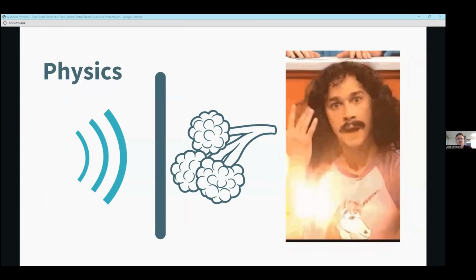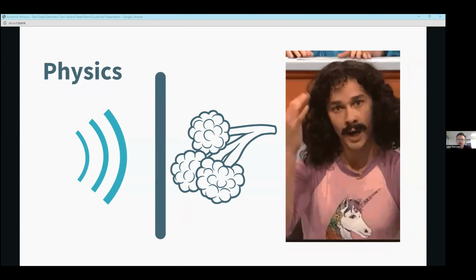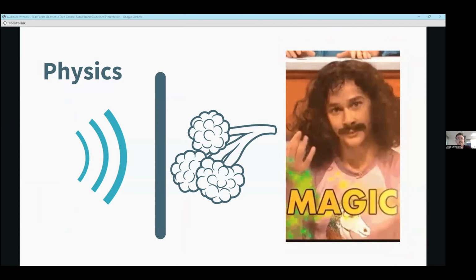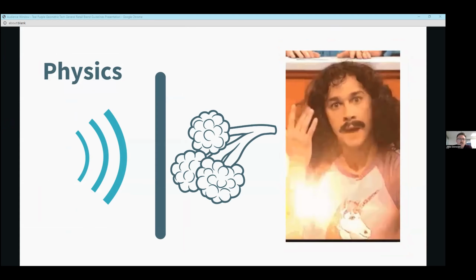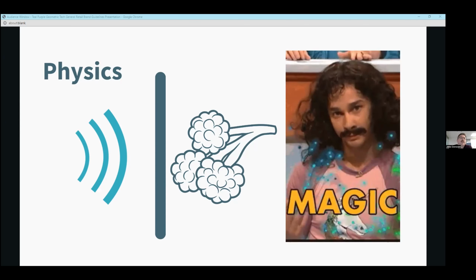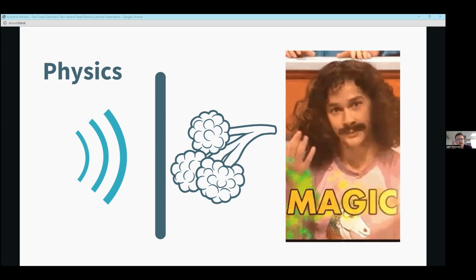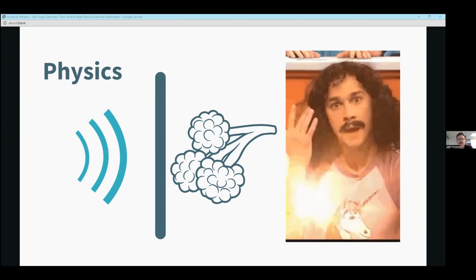Just a quick physics topic here. Again, this is the most basic physics, just a quick overview. I found ultrasound physics to be wildly complicated. I prefer to think of it as magic. But air is a very strong reflector of sound, and generally speaking, 99 point something percent of sound waves are reflected back to the probe. I like to think about the lung as being an unbroken barrier of air under normal circumstances, and when it is broken, that's when we're able to see the pathology.